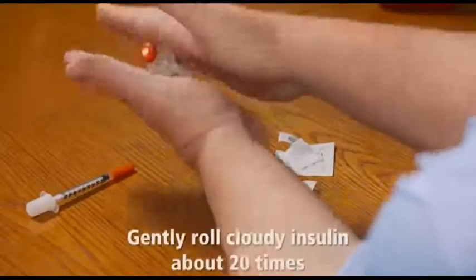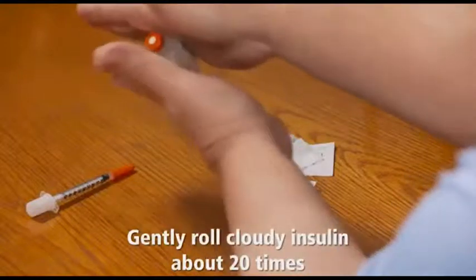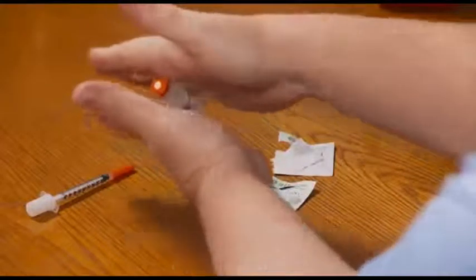If you're using cloudy insulin and it looks okay, gently roll the bottle between your hands about 20 times until the liquid is well mixed and has an even look. Be sure never to shake your insulin. That could create air bubbles or even damage the insulin.